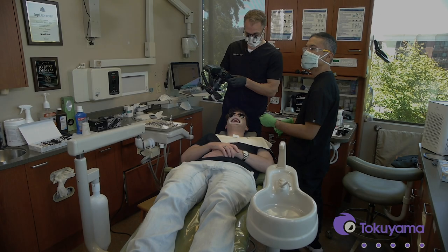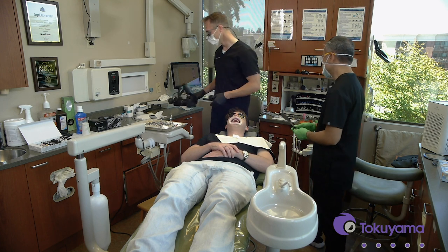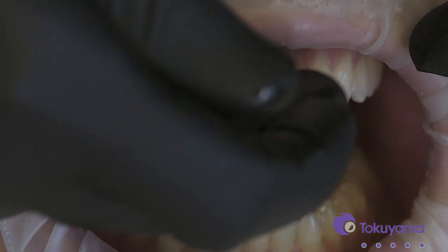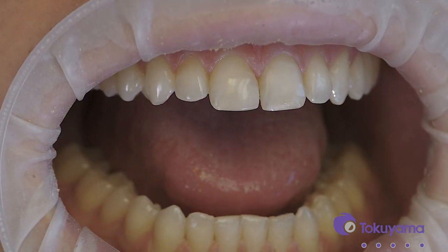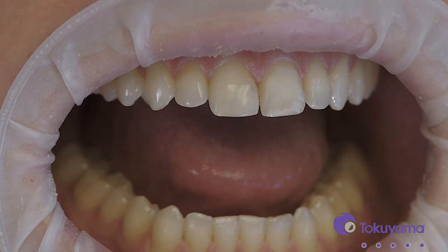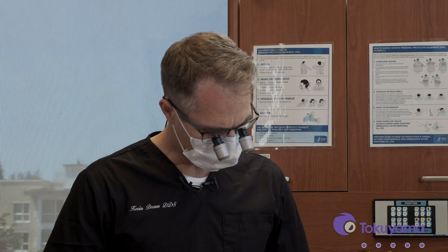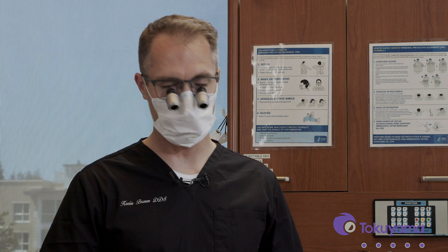I can zoom in on that as close as I want to get and it is just perfectly, perfectly invisible — that is just awesome stuff. Mason, if he wanted to whiten his teeth at some point, this composite will blend in with it because it's gathering its color from the surrounding tooth. As time goes on his composite is still going to match because it will just blend in perfectly. The technology behind it is wonderful, and I hope you guys can find as much joy and success with it as I have.